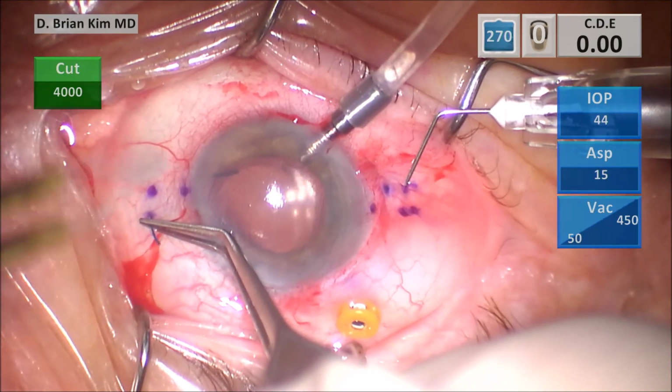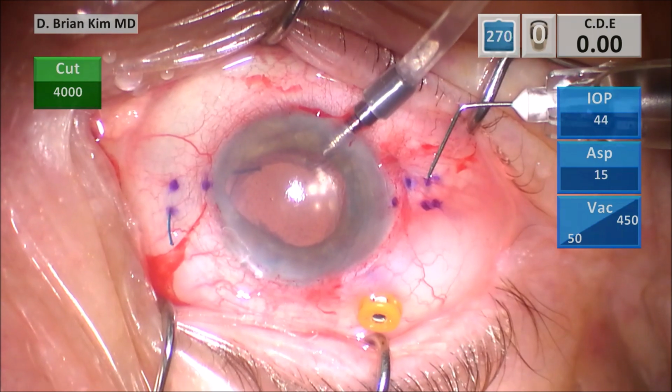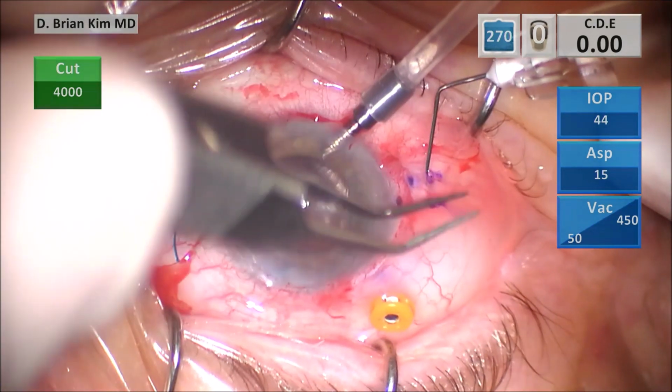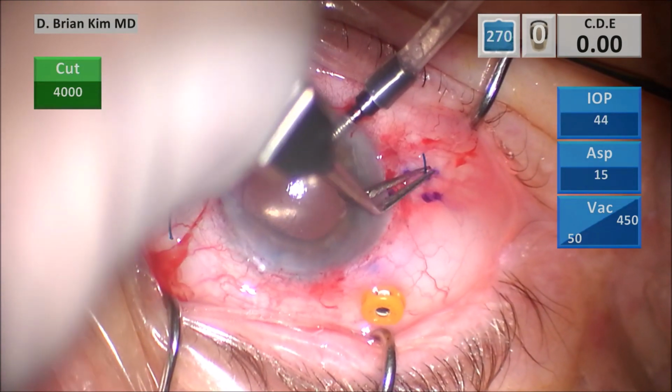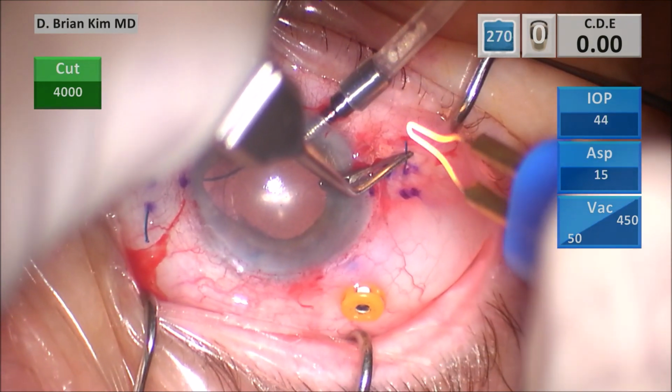And then I'm going to cauterize the tip here, create a small bulb there, and then go ahead and pull out the right side one as well, grabbing the tip. And again, you want to make sure the forceps are ready to grab. You don't want to be fumbling around and then worry that it might slip back into the eye.